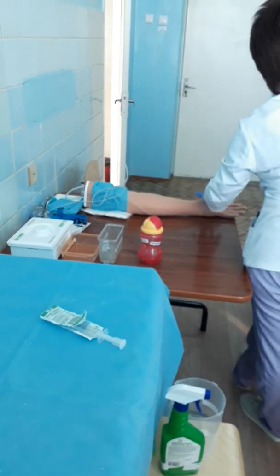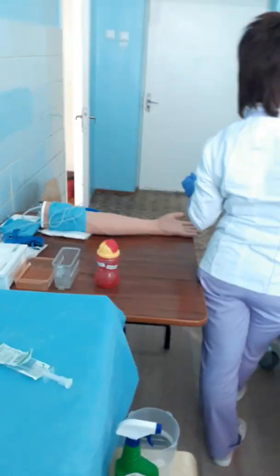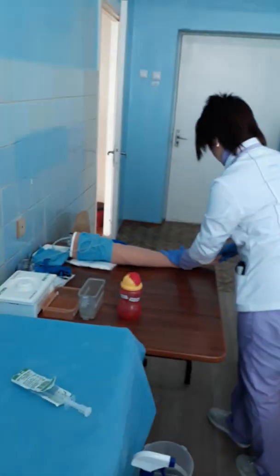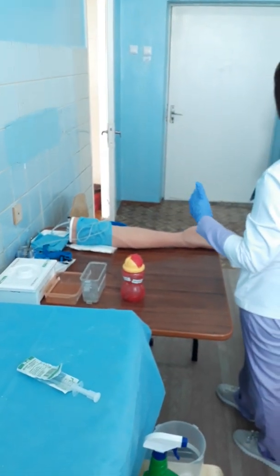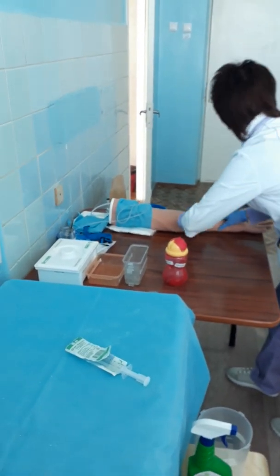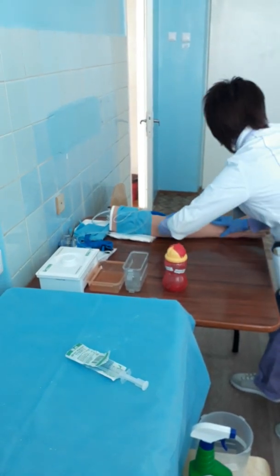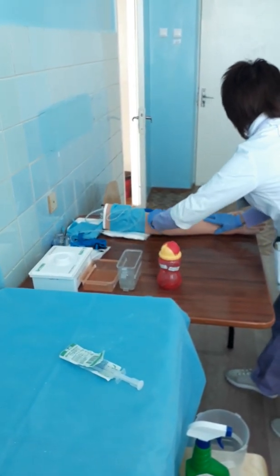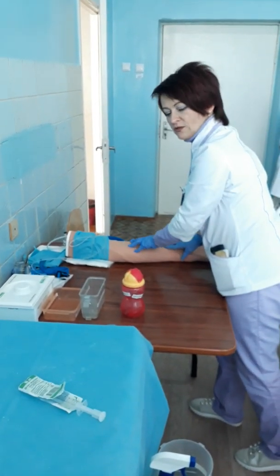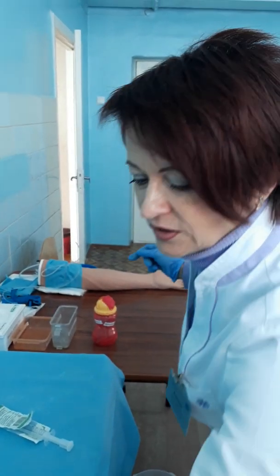After that, you ask your patient, please squeeze and press your hand like a fist. Or if your patient doesn't do it, you can have him do it 3 or 5 times, so this part of the palm collects blood in the venous. After that, you palpate the venous, and only after that, with the tourniquet, you start to clean it.